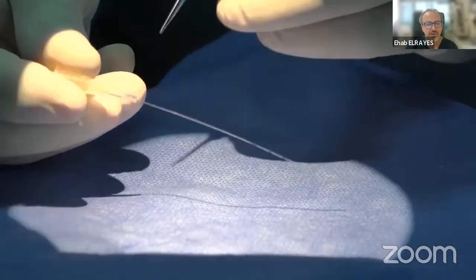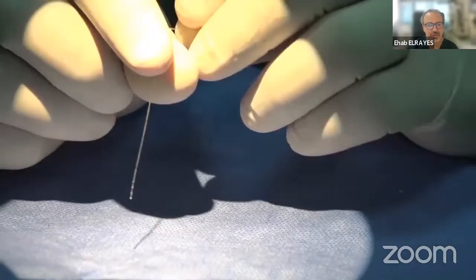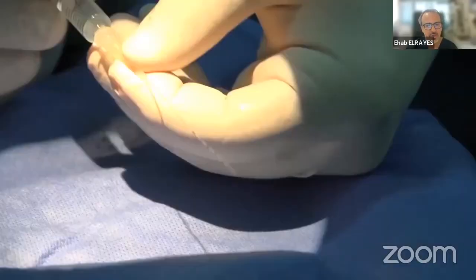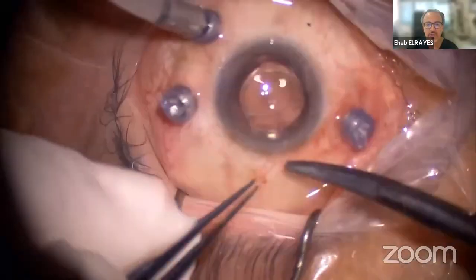Then we developed another catheter that is non-illuminated. By time we found that we don't need an illuminated catheter. We can use this drug-delivery catheter that we developed with Med1 to inject the filler in a similar technique without the need of the light.